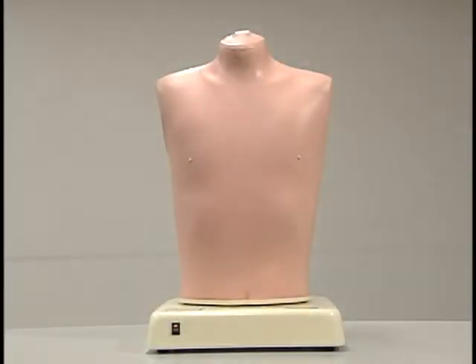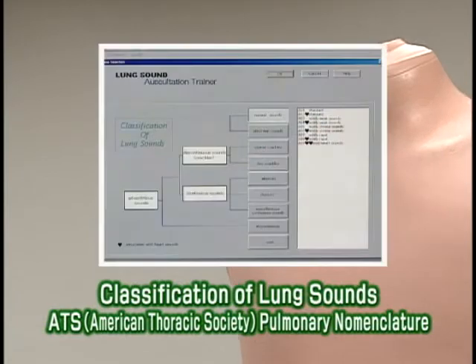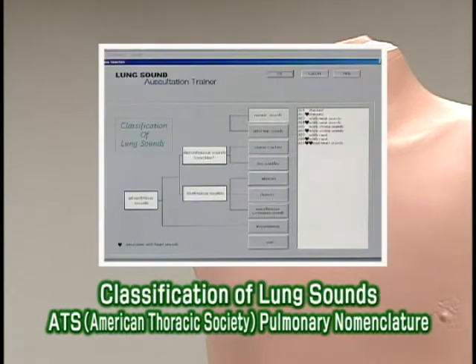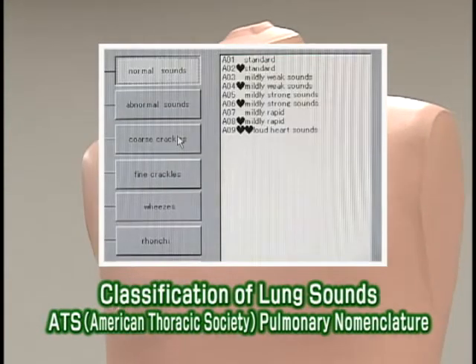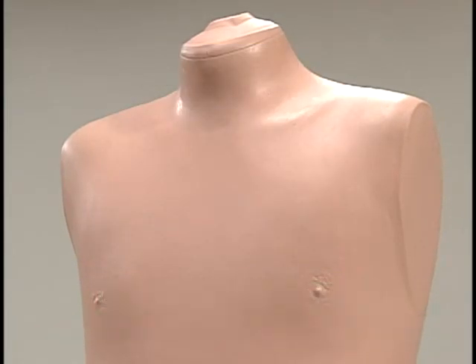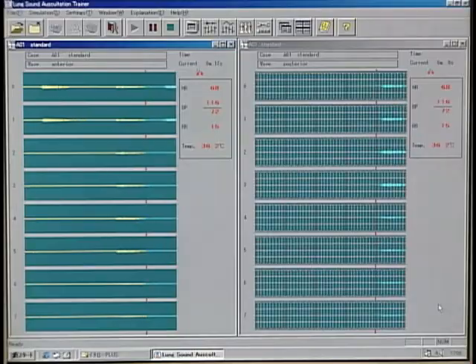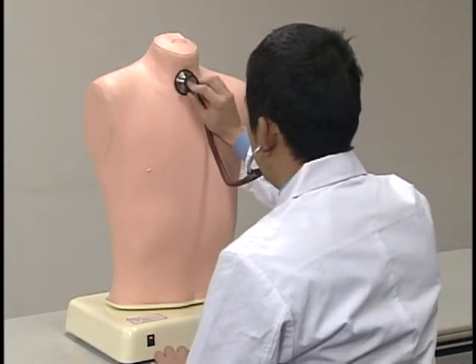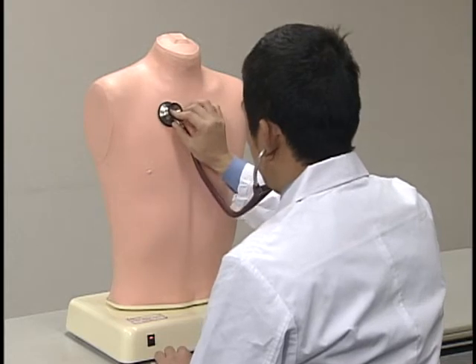The simulator is designed to provide authentic lung sounds auscultation training, conforming to American Thoracic Society standards and classifications. Lung sounds are authentically reproduced on a life-sized torso, providing three-dimensional listening, seamlessly changing in relation to lesion sites.